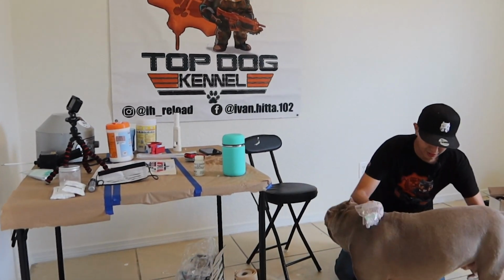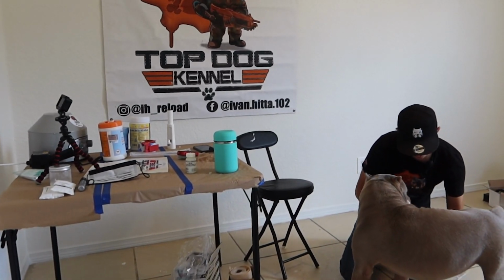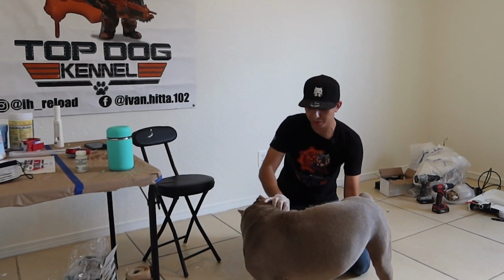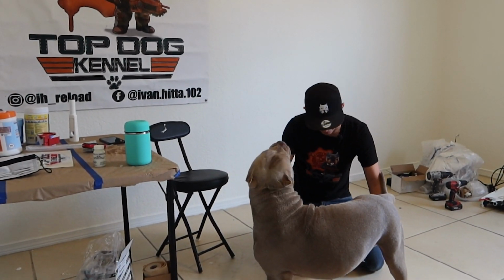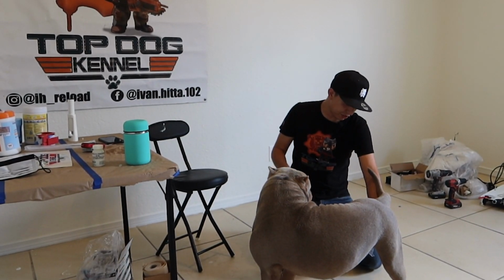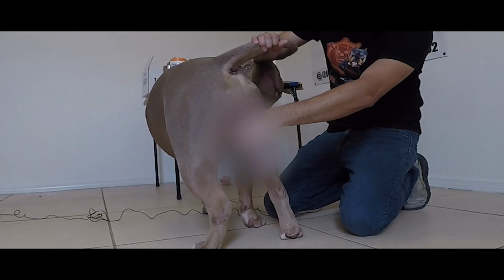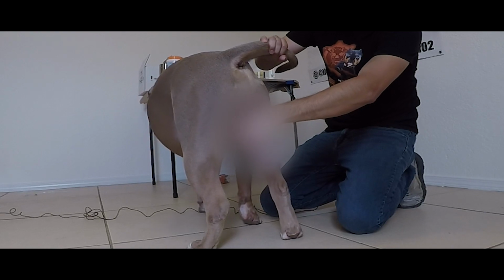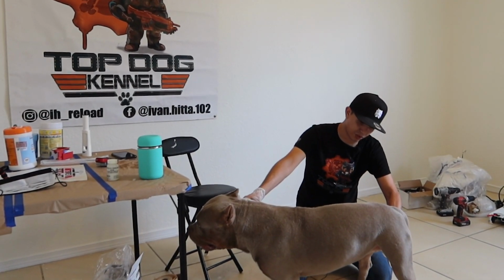Come here, boy. So what you wanna do is, when you grab the male, there's a little bulb underneath him. You wanna hold down that bulb and then pull back. You don't have to do any thrusting, you don't have to do anything. He's gonna do it all. If he needs assistance, we can get a female for him, just so he can sniff her, but a lot of the times the male is able to just do it on his own.